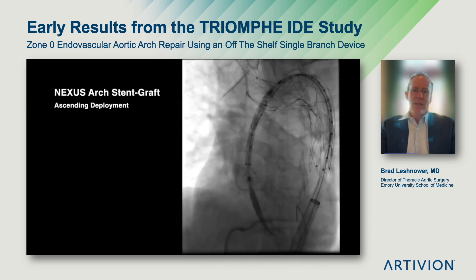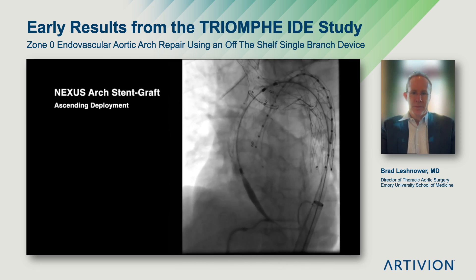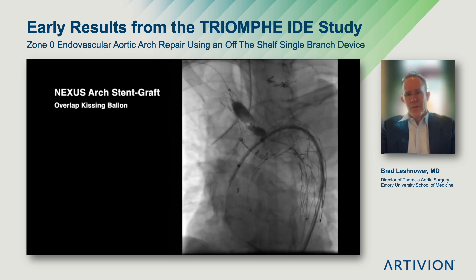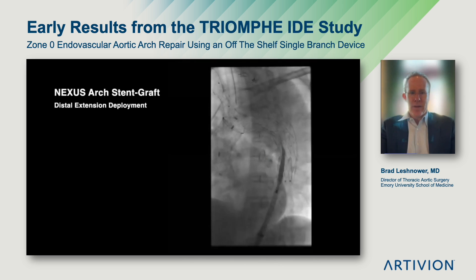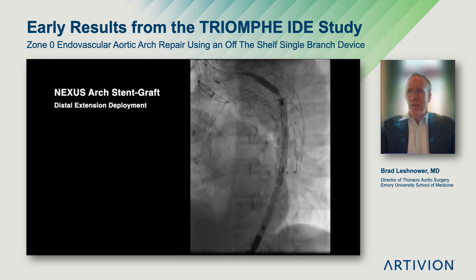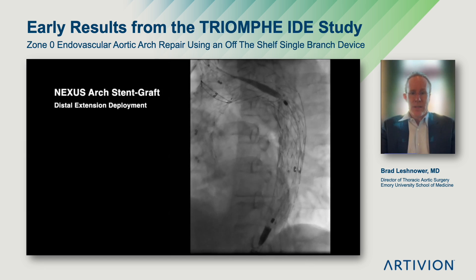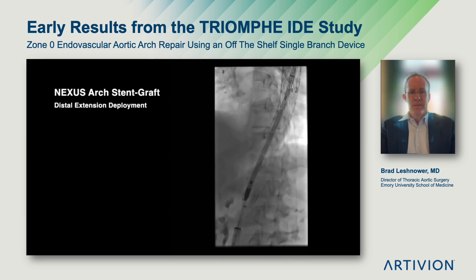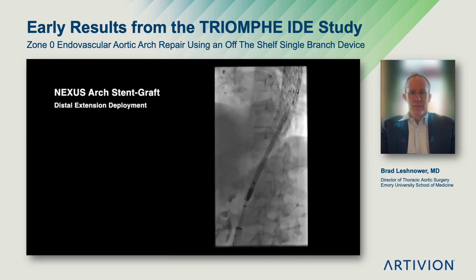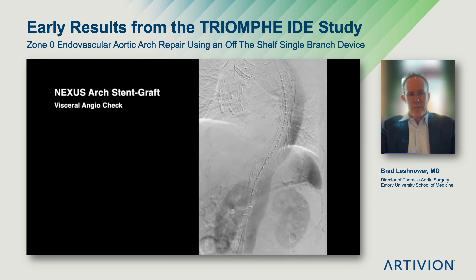Under rapid ventricular pacing, the ascending component is deployed. Next, we balloon the branch in the brachiocephalic trunk and the overlap in the dock. Another aortogram confirms patency. In this patient, we wanted to stent all the way to the celiac to exclude any secondary thoracic intimal tears. So we used two distal pieces, which were deployed in a standard fashion without difficulty. The completed aortogram shows brisk visceral perfusion and, as expected, some retrograde false lumen perfusion.